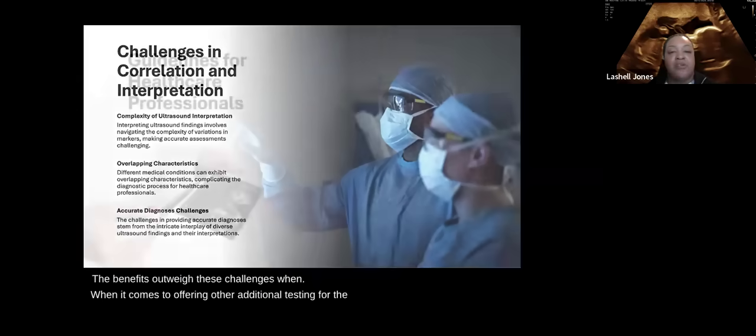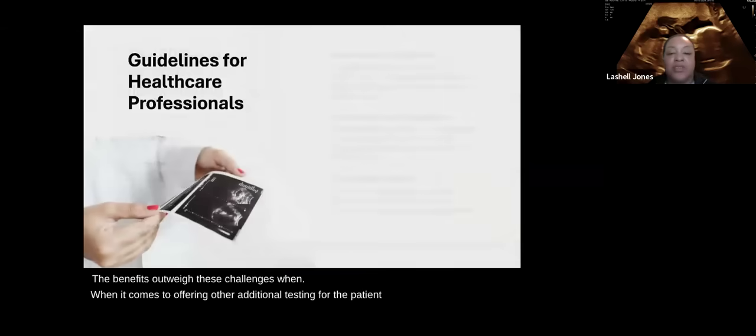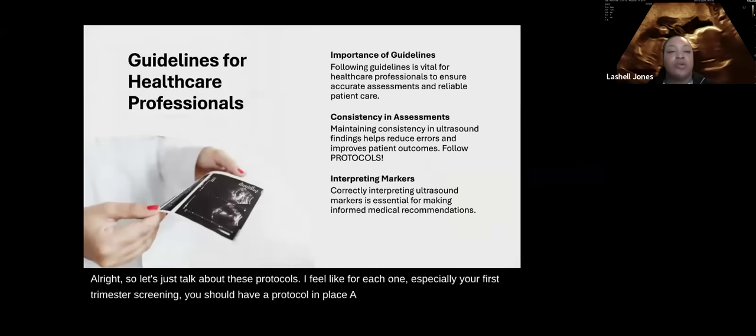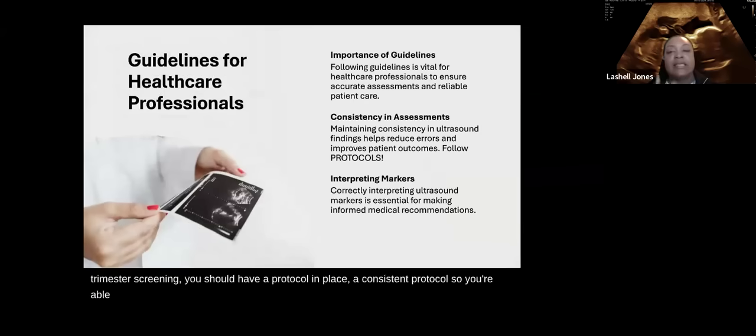Okay. All right. So let's talk about these protocols. I feel like for each one, especially your first trimester screening, you should have a consistent protocol in place, so you're able to consistently check for these markers early on, because I feel like early diagnosis is key.